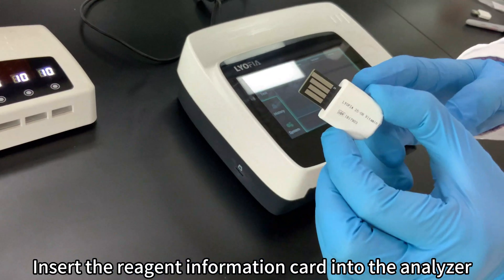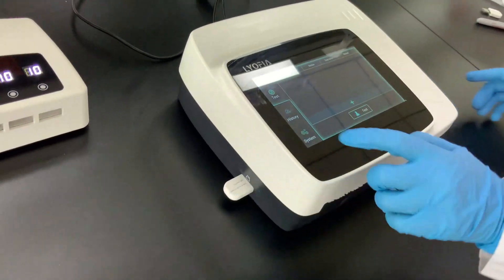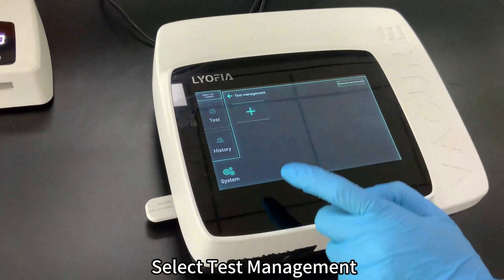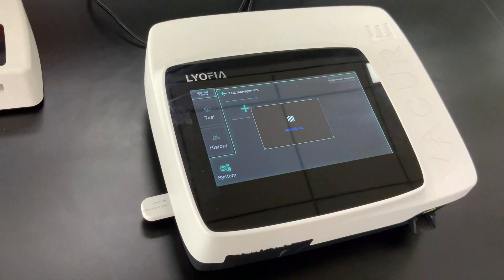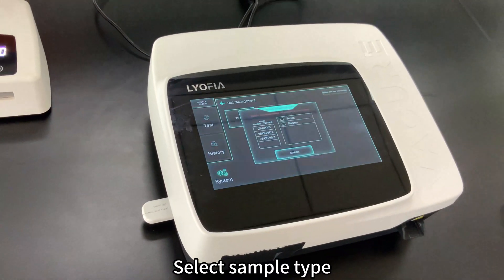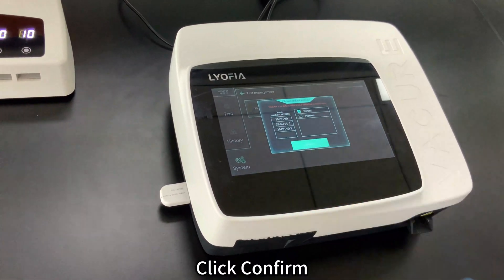Insert the reagent information card into the analyzer. Click System, select Test Management, click Plus, select sample type, then click Confirm Edit.